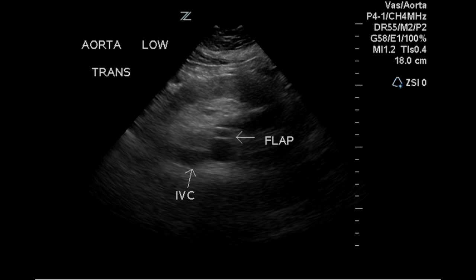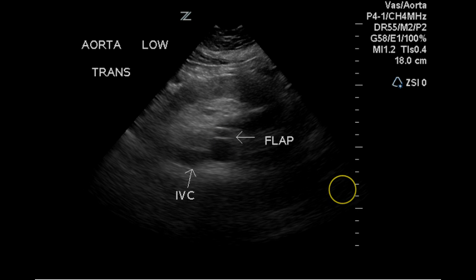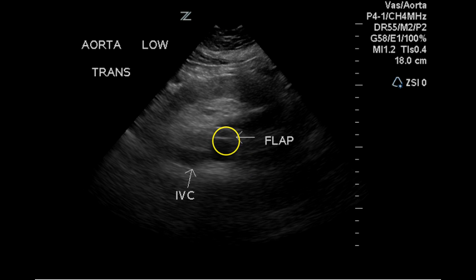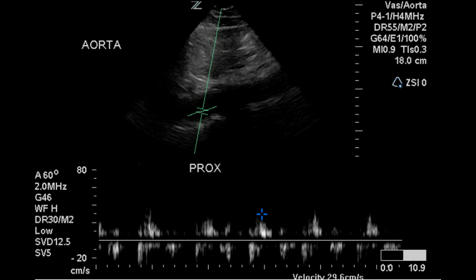Another image of the distal aorta demonstrates this linear, smooth-appearing echogenic flap. This raises the possibility that there is an intimal dissection occurring in this portion of the aorta.